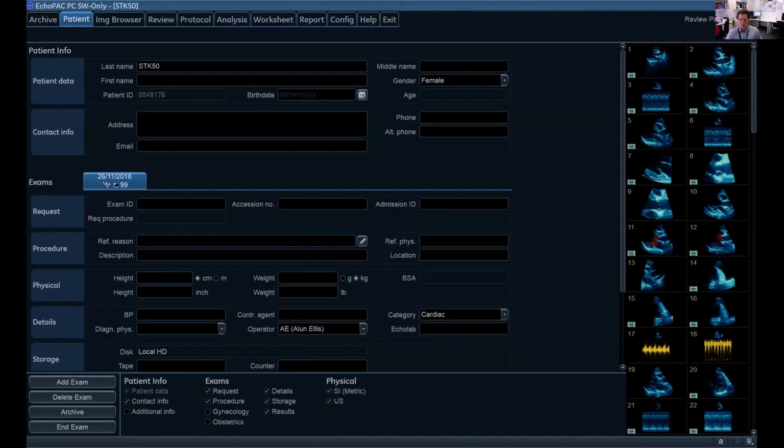Hi guys, welcome. We're going to go through tamponade and pericardial physiology this week. Probably just going to do it without the whiteboard so much because I think everyone's going to know a lot of the echo stuff, and hopefully I can just go through with a few images from previous talks.